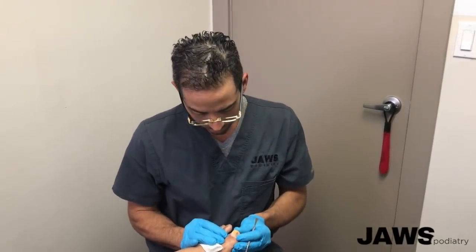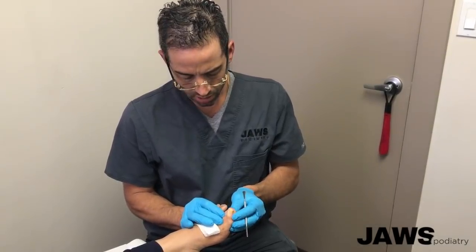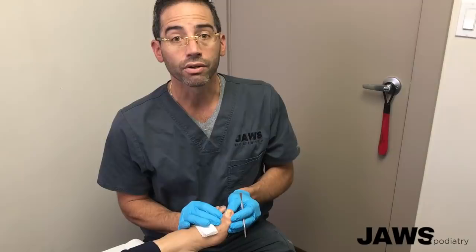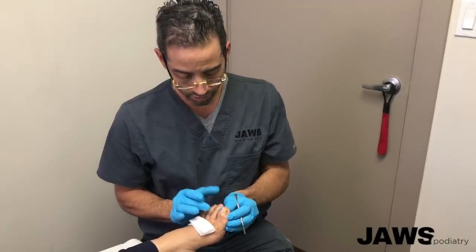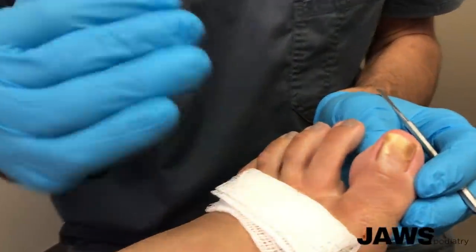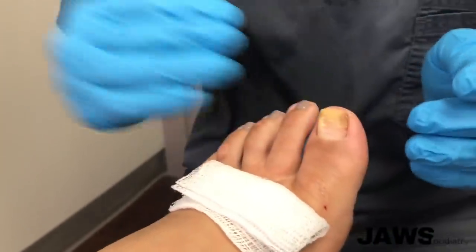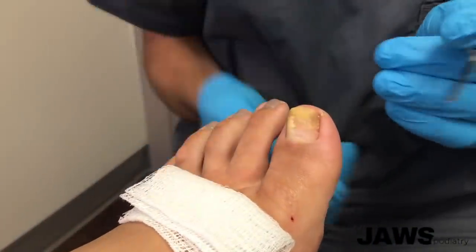Hello everyone, hope everyone had a great weekend. This morning we have a patient who has presented with a recurrence of an ingrown nail. Not only is it ingrown, but as everyone can see, the nail is very thick. Having a thick nail plus the fact that it's ingrown can cause a significant amount of pain anytime anything presses down on the nail.